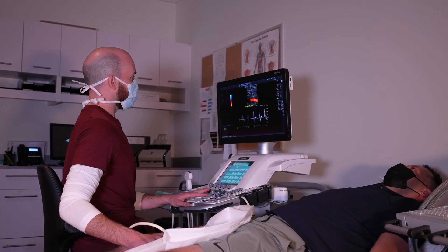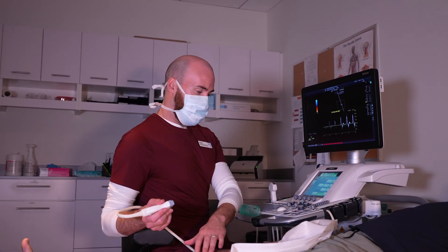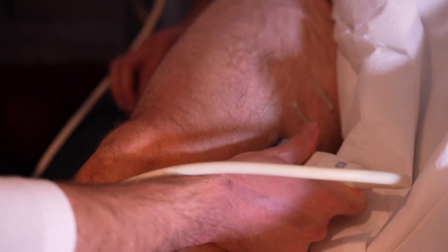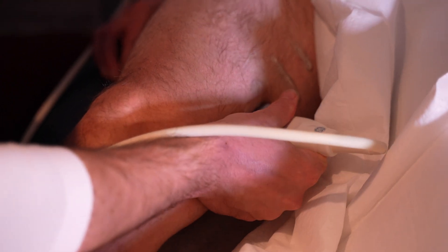The majority of our tests are performed on the legs and it's for patients who've got pain when they're walking, numbness, tingling, cold sensation in their legs, or non-healing wounds. We perform an ultrasound scan looking directly at the blood vessels in real time to assess for any narrowings or blockages.